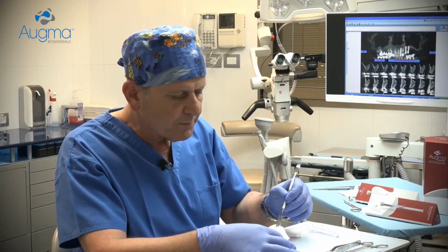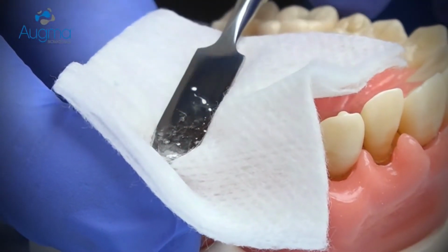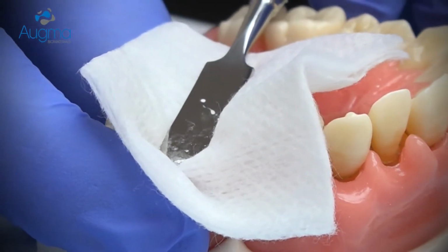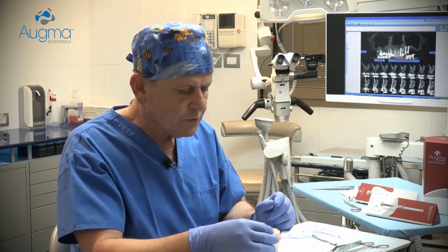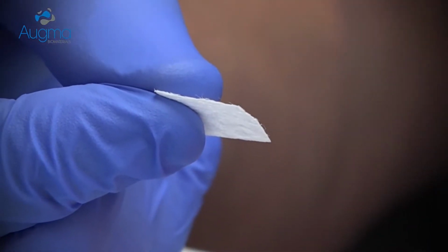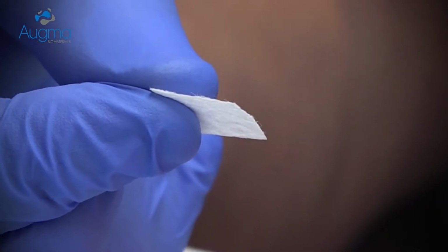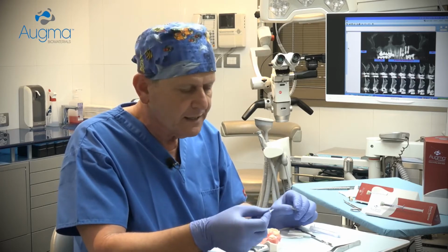Now, if there is not enough place for your finger between the teeth, use a spatula or an elevator and press above the dry gauze. Now, you cannot leave the material exposed. What you need to do is to take a barrier, which can be a simple collagen sponge, and place it above the graft. However, it must be sutured together with the soft tissue. So the technique is in that way.